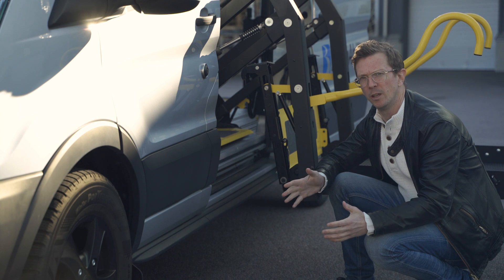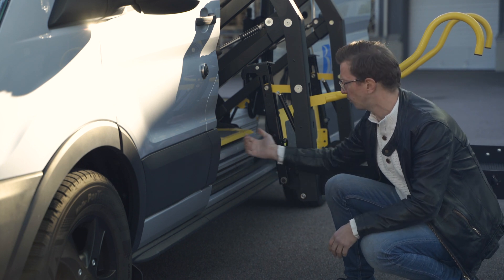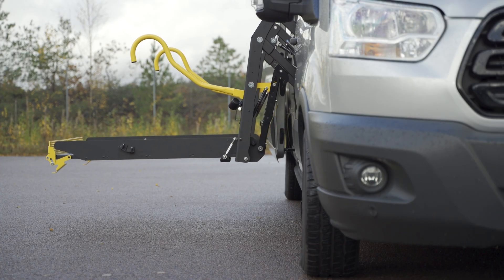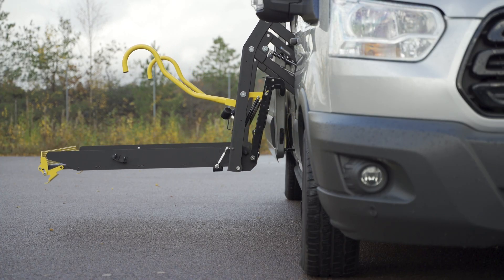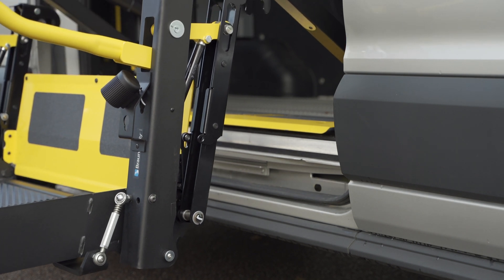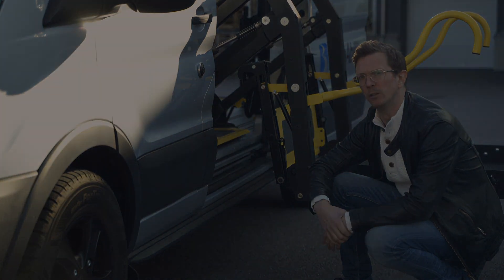Finally, we have the kick-out. This is how far out the platform reaches — more specifically, it's the distance between the base of the lift and the platform. The E-Series has an ample kick-out, which means greater bumper clearance and makes installation possible in many vehicles.